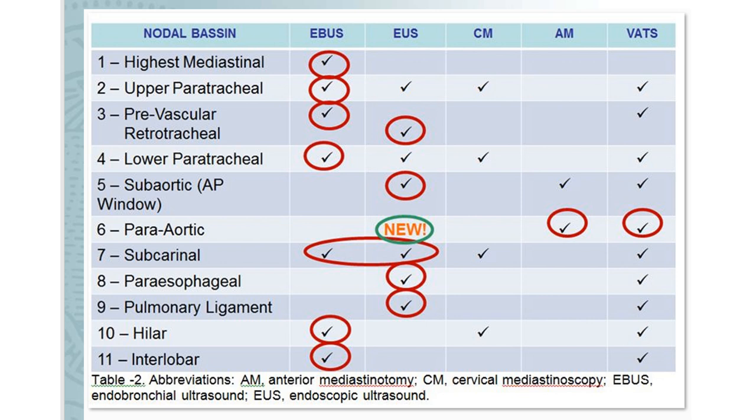And in addition, some of these studies done on combination of EBUS EUS, for example, in the Wangbo study from Korea, what they noted was, interestingly, the lymph nodes that were missed by EBUS and picked up by EUS were not in the inferior mediastinum, but in stations 4L, 5, 6, and 7. As well in Wallace's study on a combined EBUS EUS, this is because of better visualization of 4L and 7 from the esophagus, which is what they noted.